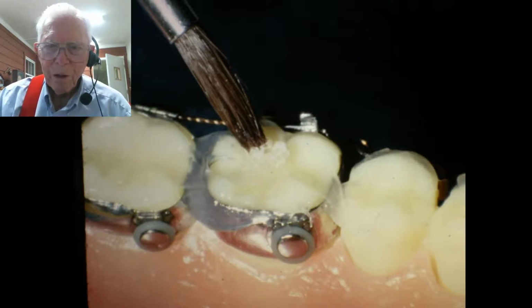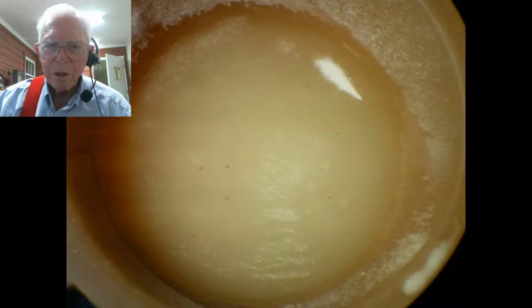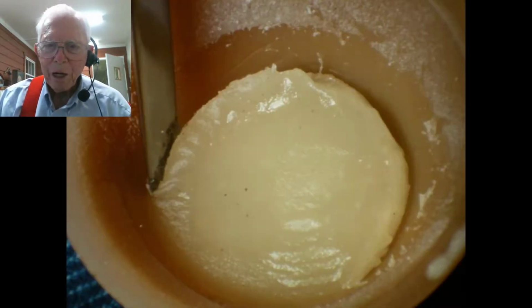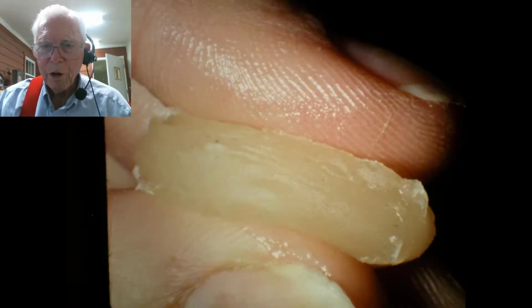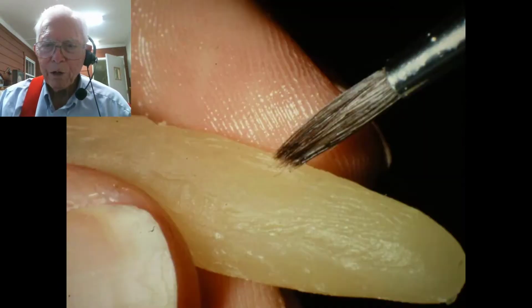And we put some Vaseline or something around it to keep them from getting the stuff in between, or some wax, better say wax. And now we'll take this part. This is this little bowl with acrylic in. We're going to roll it out, and it's kind of magnified there now, and we get it out, and it's kind of solid, but we can work it with our hands. So we take it and mash it out in shape like this block we're going to bond it to.